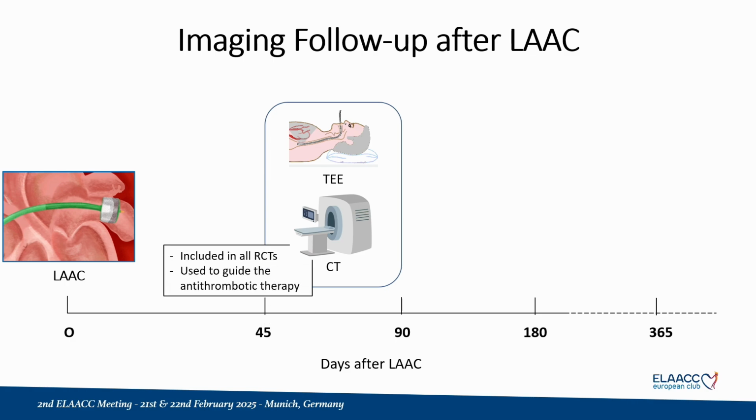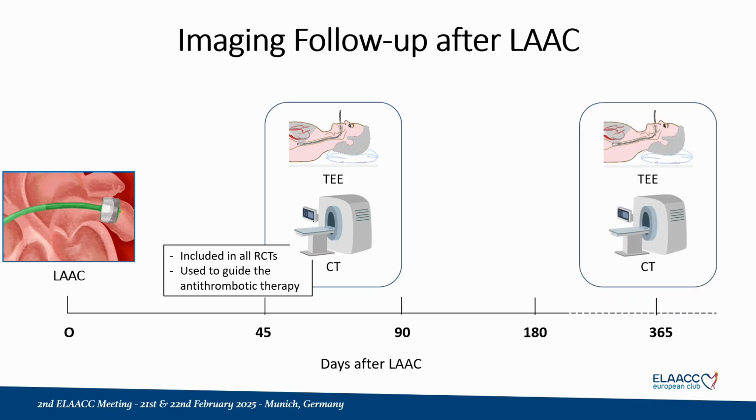This was included in the study protocols of these trials, and this imaging follow-up was used to guide antithrombotic therapy. And then, according to the study protocols of these 2 trials, we should repeat an imaging follow-up at 1 year.